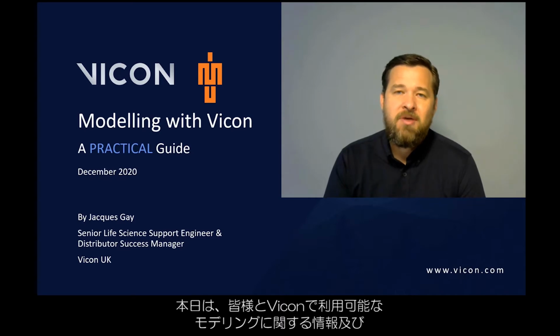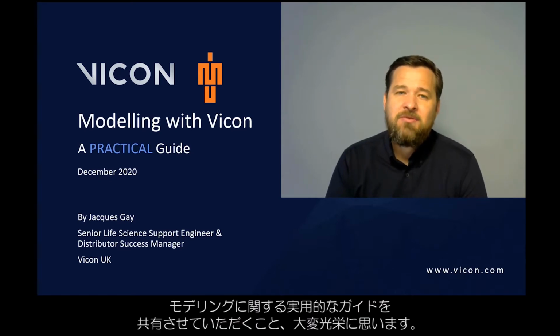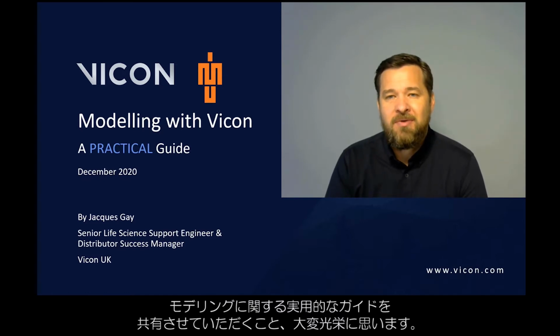I'm a Senior Support Engineer at VICON, and it is a great privilege and honor to be sharing with you some of the modeling information that we have available at VICON, as well as give you a practical guide on some modeling options within Nexus.